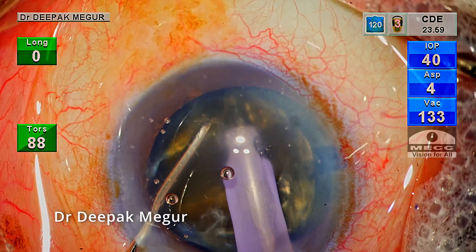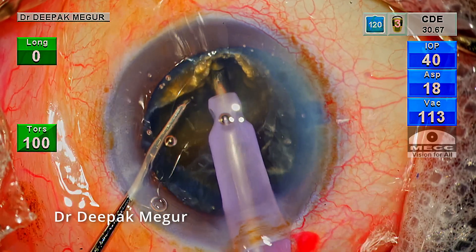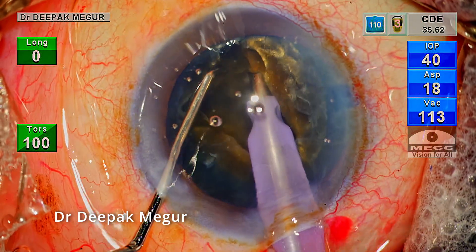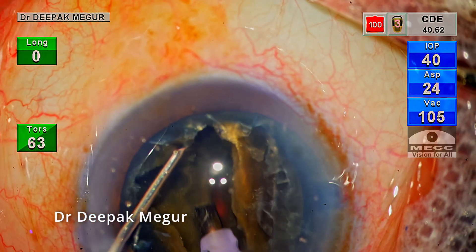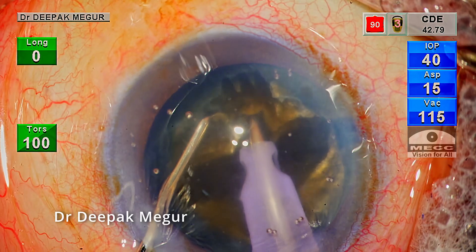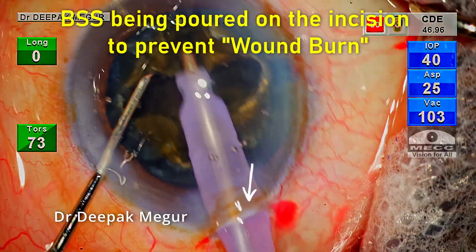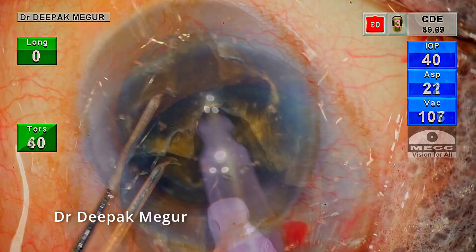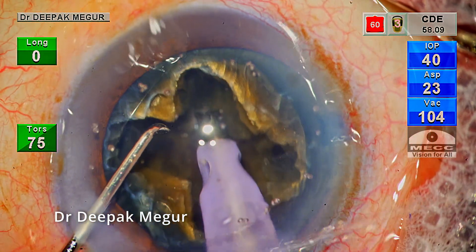The same principles are utilized: stabilize the nucleus, make a wider trench initially and then go deeper. The nucleus is rotated 90 degrees and I come back to the original trench, lengthening and deepening it. The goal is to deepen the trenches to about 90% depth. My assistant is always pouring BSS on the incision to prevent wound burns. It's very critical to have at least 90% depth since dividing the nucleus is going to be quite difficult in this cataract.